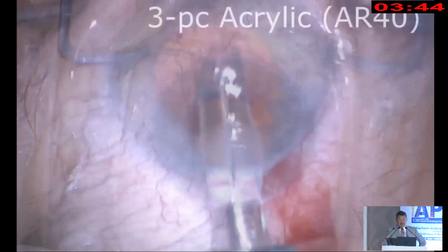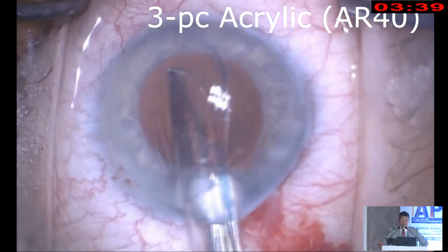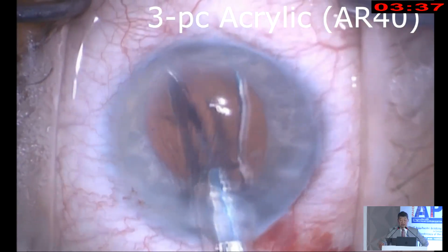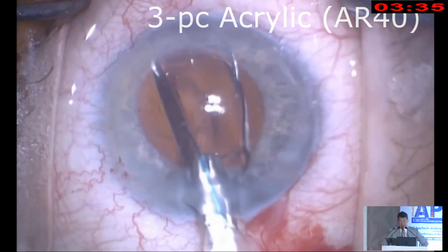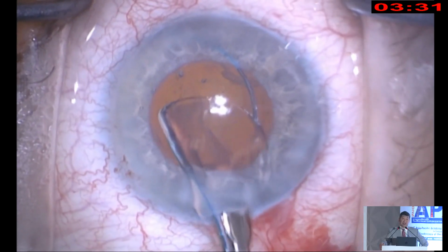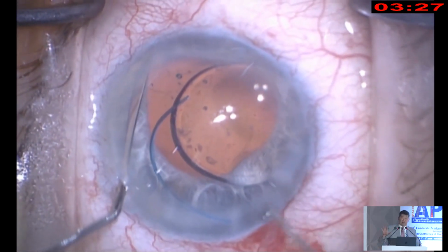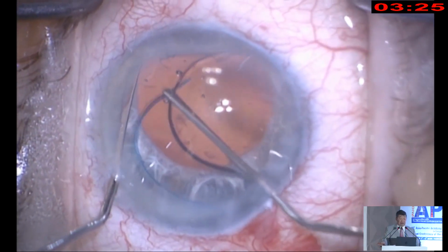And I think you can see here I'm trying to put viscoelastic to open up that space in between the iris and the anterior capsule, and this again lets me get into that space. So it is important that the rhexis isn't too small. Once in a while the zonules are so bad I can't capture it. The bag wants to go back too far, and I would leave it in the sulcus.